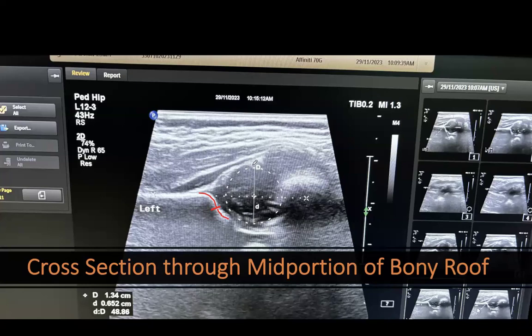This is the synovial fold, which is overlapped by this letter D. This is the capsule. This is the labrum, cartilaginous roof, and bony roof, starting all the way from here, going down all the way medially. And then you trace your turning point starting from distal medial to proximal lateral. So you're seeing all these points. So this image passes checklist one.